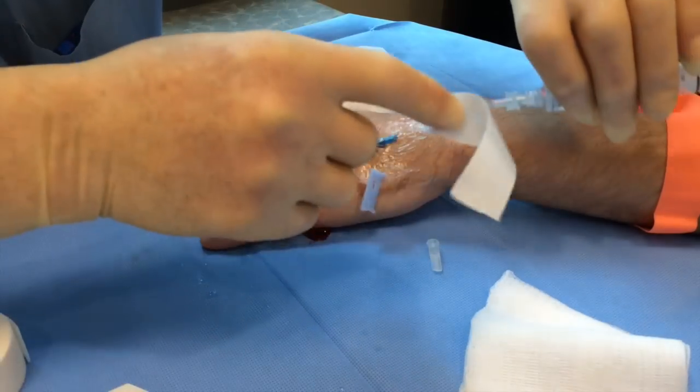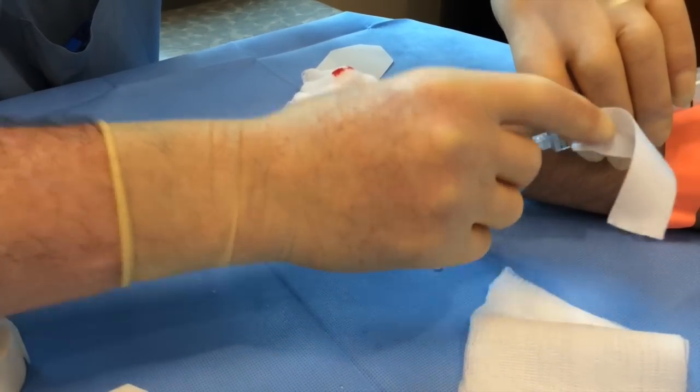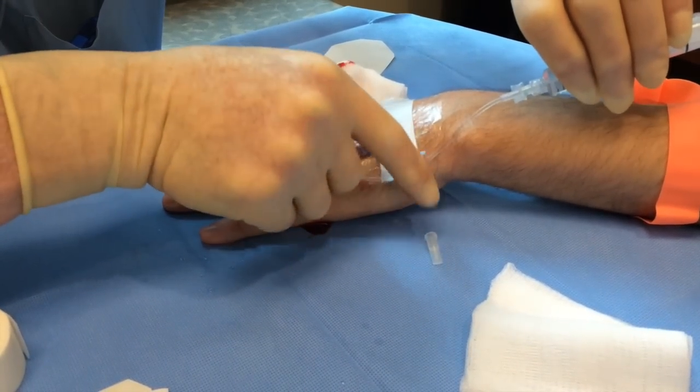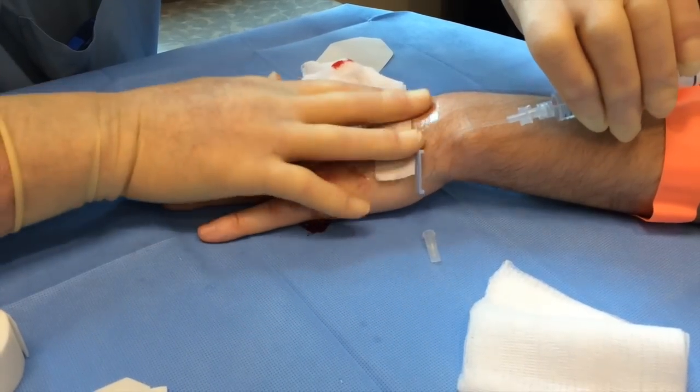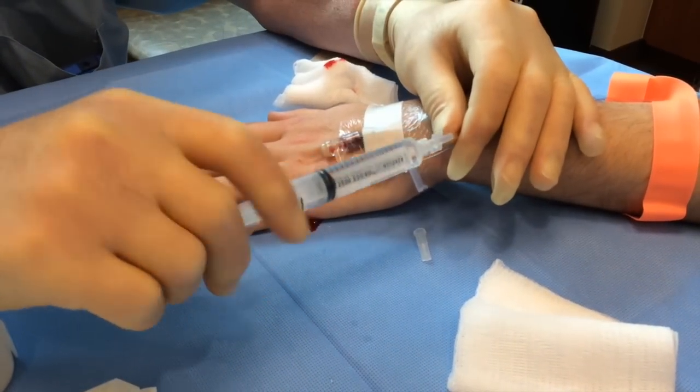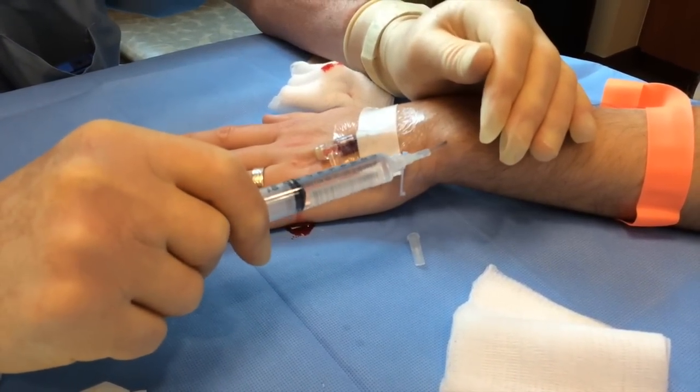Closest to the syringe, in that manner. The rest of this will connect to your IV tubing, and again, it freely injects.